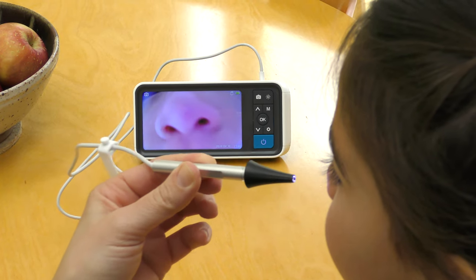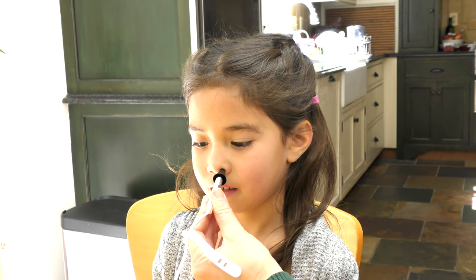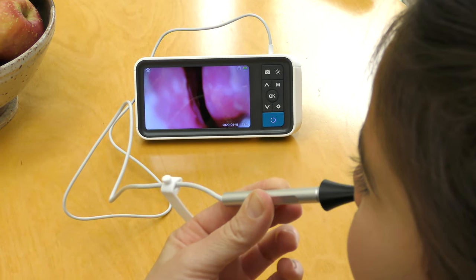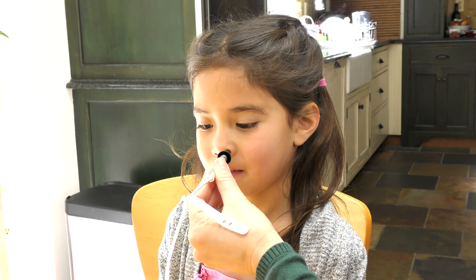When examining the nose, slowly and gently insert the camera tip up against the nasal tip. Slowly adjust the camera angle such that it is perpendicular to the face. As you can see, the septum and nasal turbinus can be easily seen, and a clear nasal passage can also be observed.